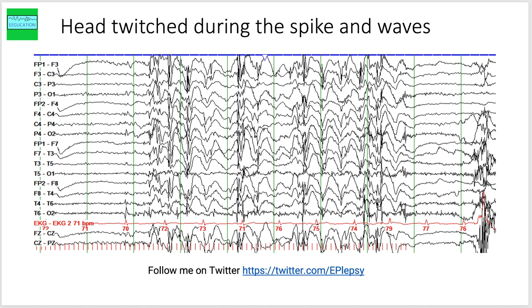This is a bit more robust response. You can very clearly appreciate the significant slowing with spike and wave discharges, which are frontally dominant, highest amplitude in the frontal head region that you see with flashing lights.